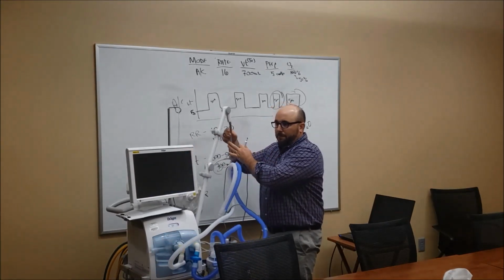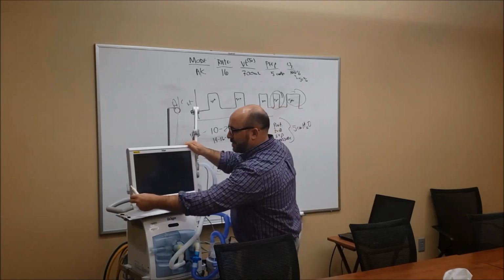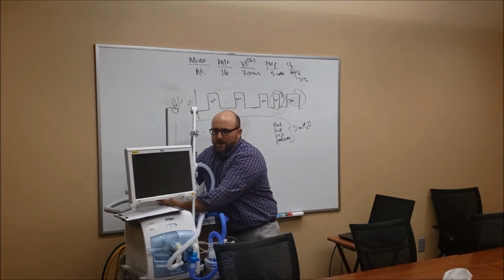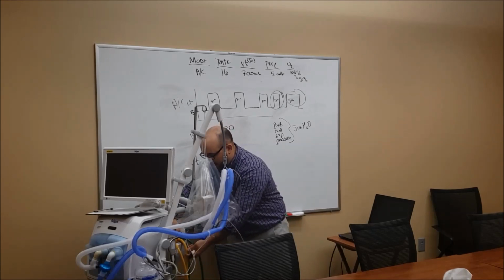I know they did an ICU. So I don't have a test lung on here, but I'm just going to show you how this screen works. We plug it in. Of course, it has to have power on the back of it, and this is all an RT thing, but it's always just really good to know what's going on. Does anybody know what these hoses are for?